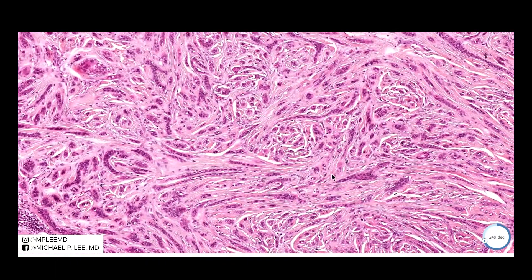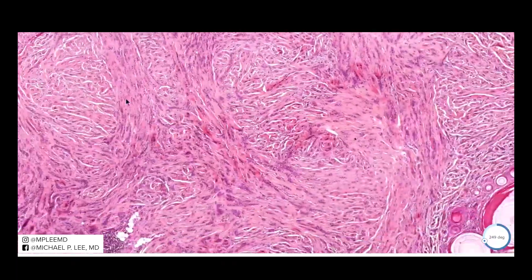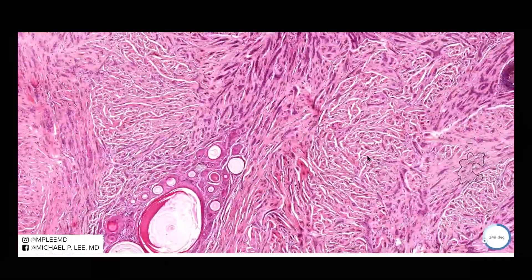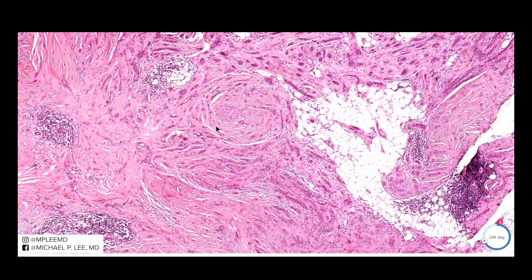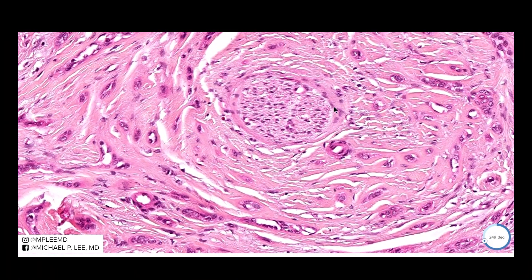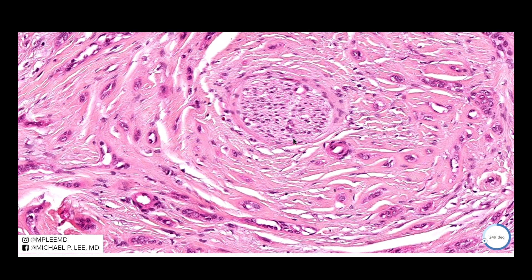I think there was another focus of possible perineural invasion here. You can see this is a peripheral nerve, and there are a couple of structures in here that are quite suspicious. I'm not positive about this, but you can throw a stain on it and easily tell if that is indeed perineural invasion.